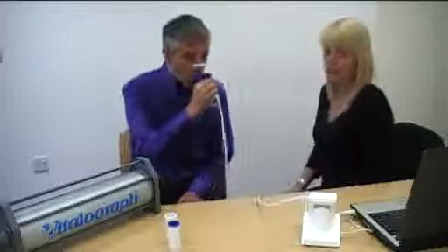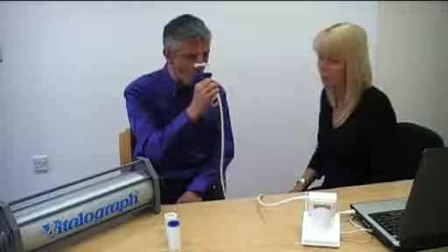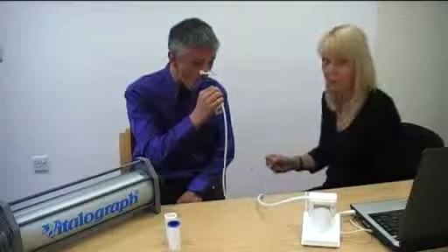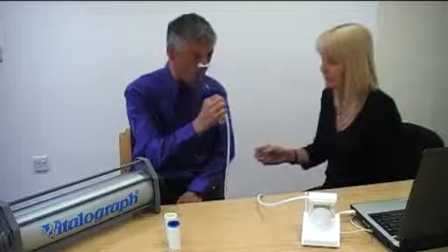And blow. Blow, blow, blow, blow, blow. Get all that air out. Blow, blow, blow. Thank you.